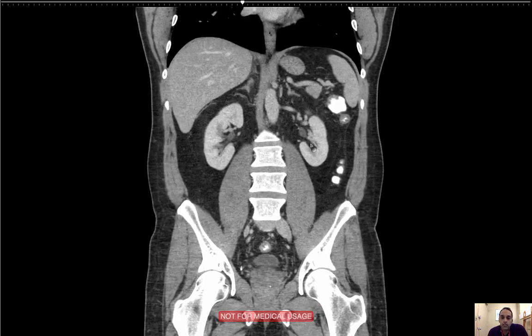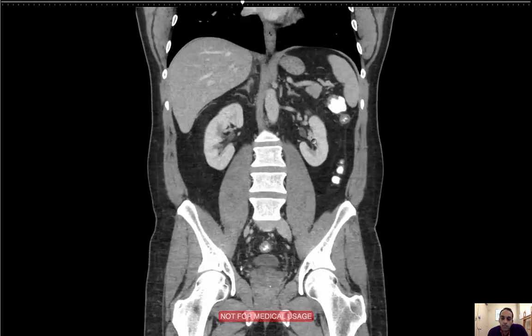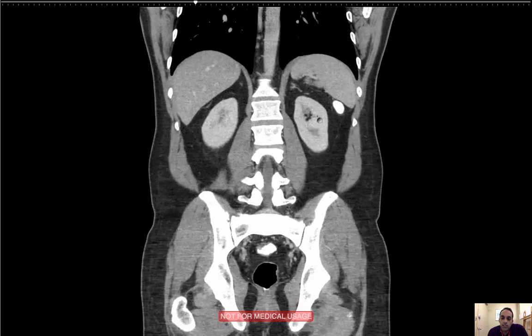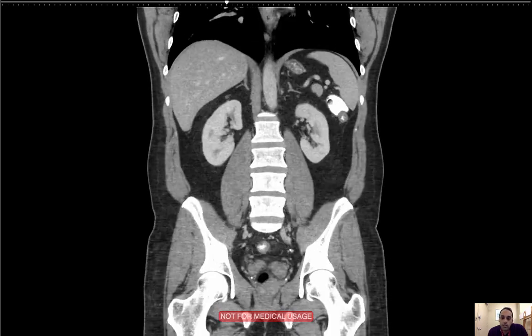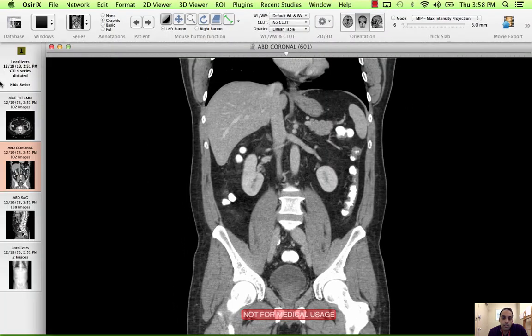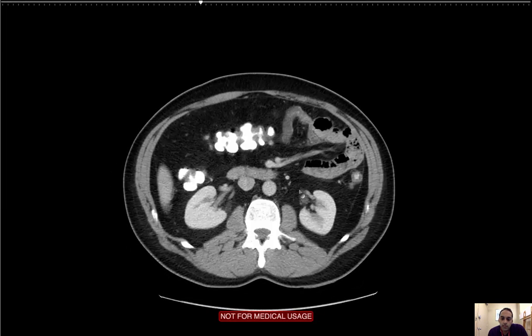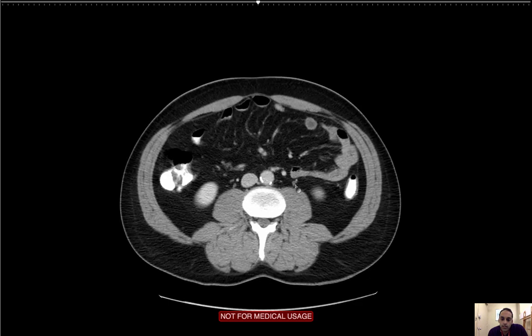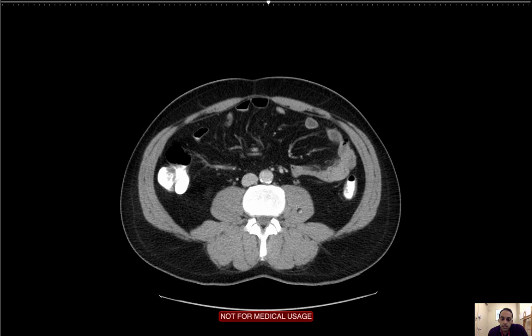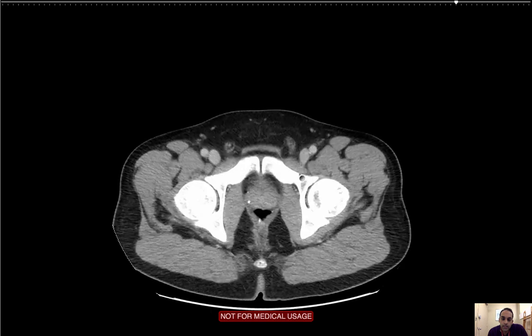I'm going to go ahead and start looking at the kidneys. I look at each kidney one by one. I'm looking for hydronephrosis, any focal renal lesions — cysts or masses — and any inflammation around the kidney. I'm not seeing any of that. I'm looking for normal symmetric bilateral enhancement with the same contrast phase on both sides. I'm not seeing any hydroureter. Going over to the axials now, I'm going to follow the ureters down. You can see the ureter extending out of the left kidney, laying right up on top of the psoas muscle. I'm looking at both ureters for any hydroureter or any stones. I'm not seeing any.